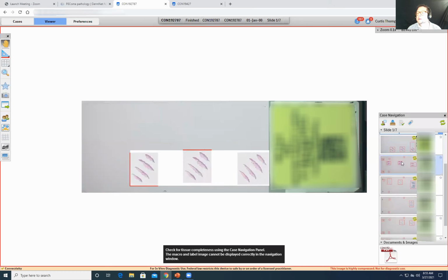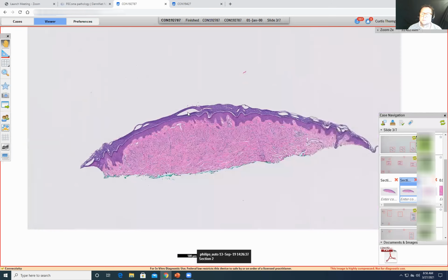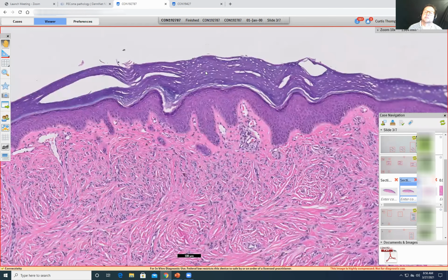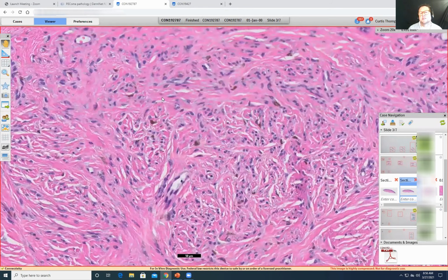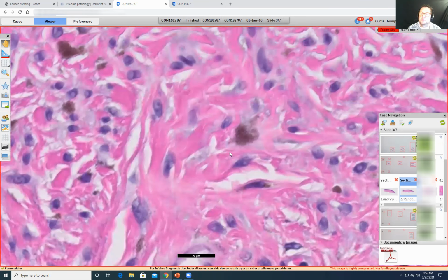So that one will do. Here you can see dome shape. Look, it's been rubbed. This is on his abdomen, and this looks like the bottom of the foot. So that is definitely been externally irritated. And then you can see the spindle cell proliferation here, nice spindle cells, and then pigmented macrophages in between them.